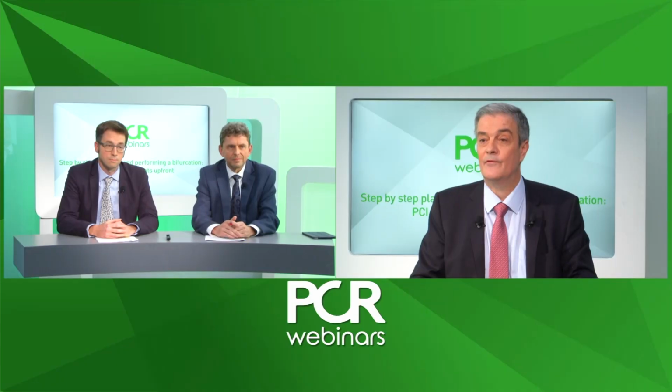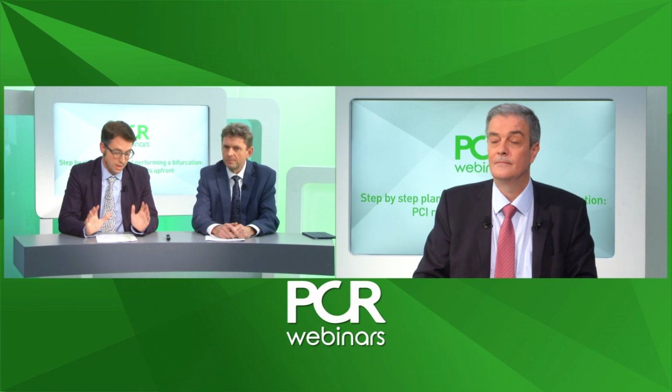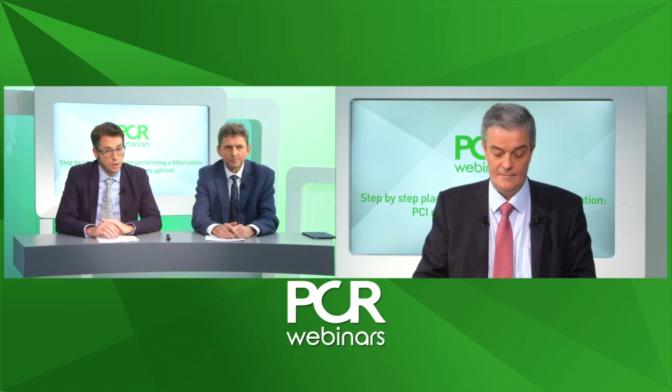So we are discussing today upfront 2-stent strategies. We have moderated and participated in many events like this one, and one of the most frequently asked questions is when 2 stents upfront are needed. Any comments, Tom? Yeah, so it's very exciting to be here this afternoon, and I think we're shifting up now from provisional stenting to complex intervention, and this is complex bifurcation disease that we're going to look at as a case example. And we have to acknowledge that although we're driven very much by guidelines, by consensus, the complexity of our patients, and more importantly the complexity of their disease, is increasing constantly. And so today, really the emphasis is on gaining strategies, understanding how we can plan and effectively give our patients the best possible outcomes in complex intervention.